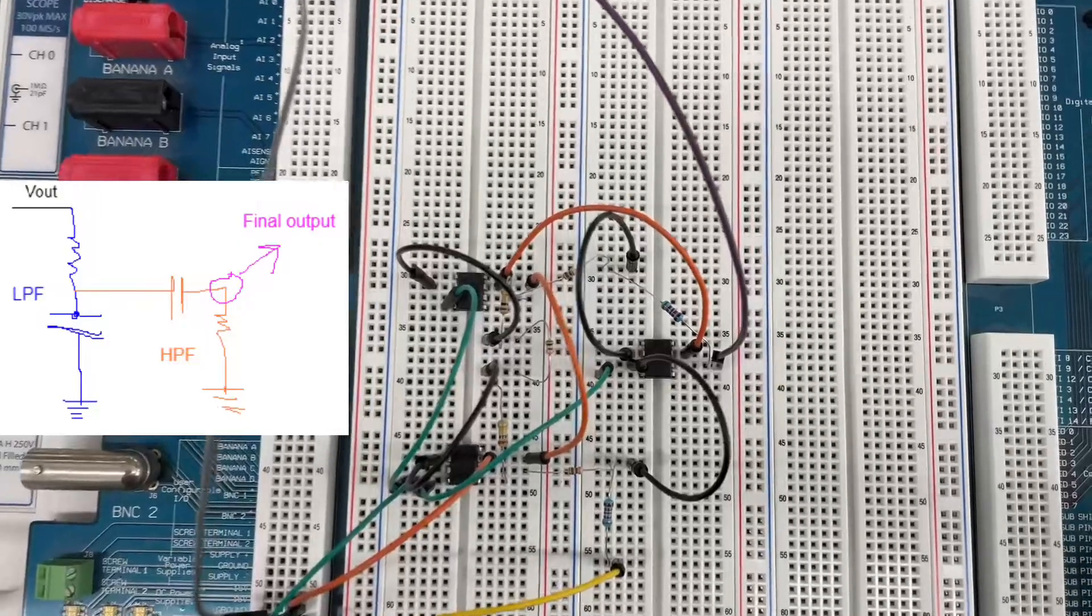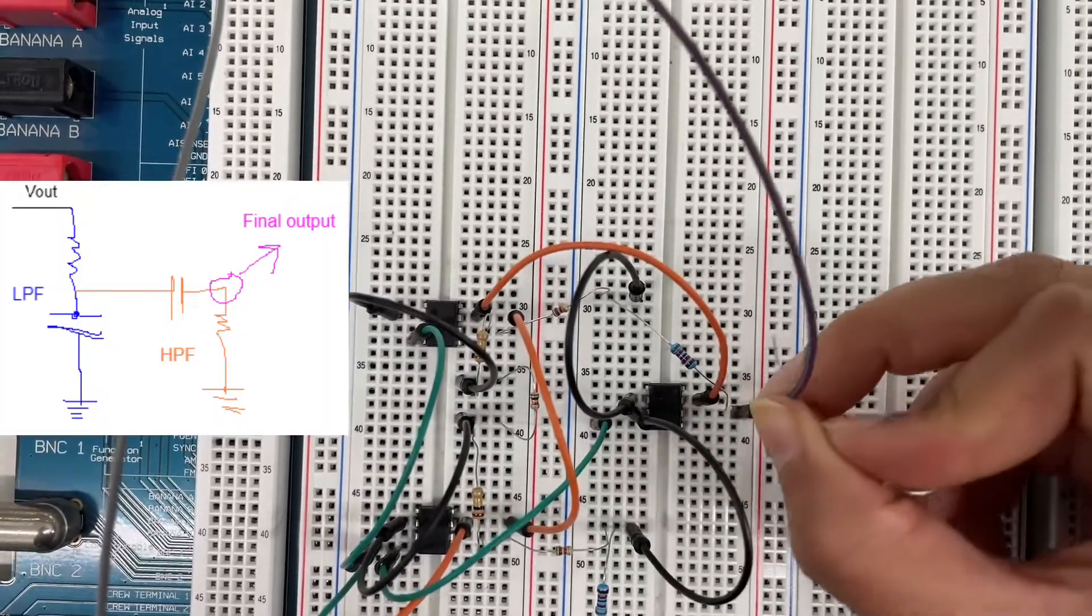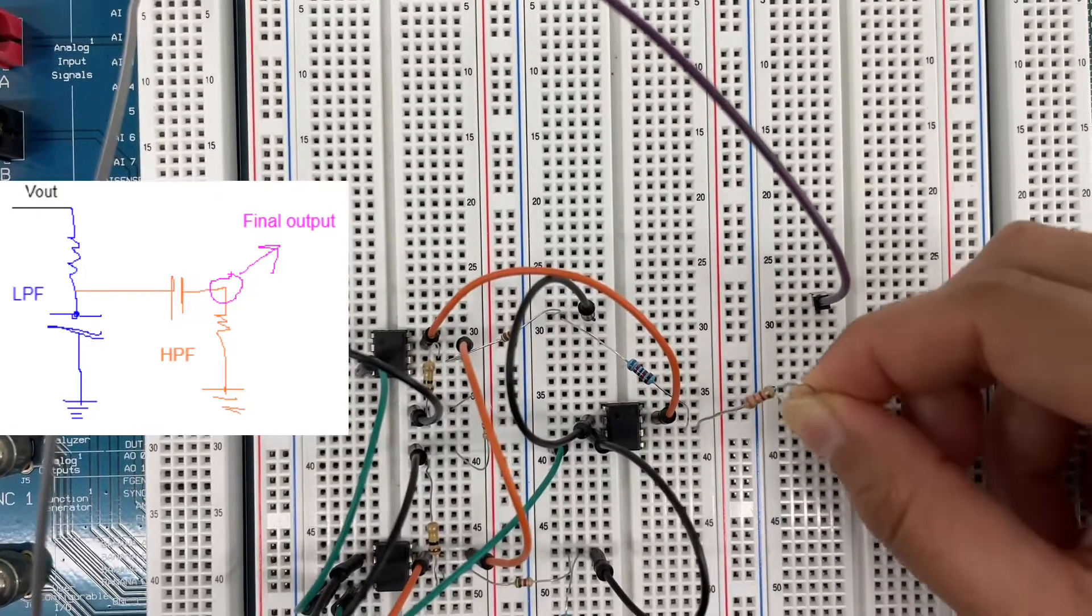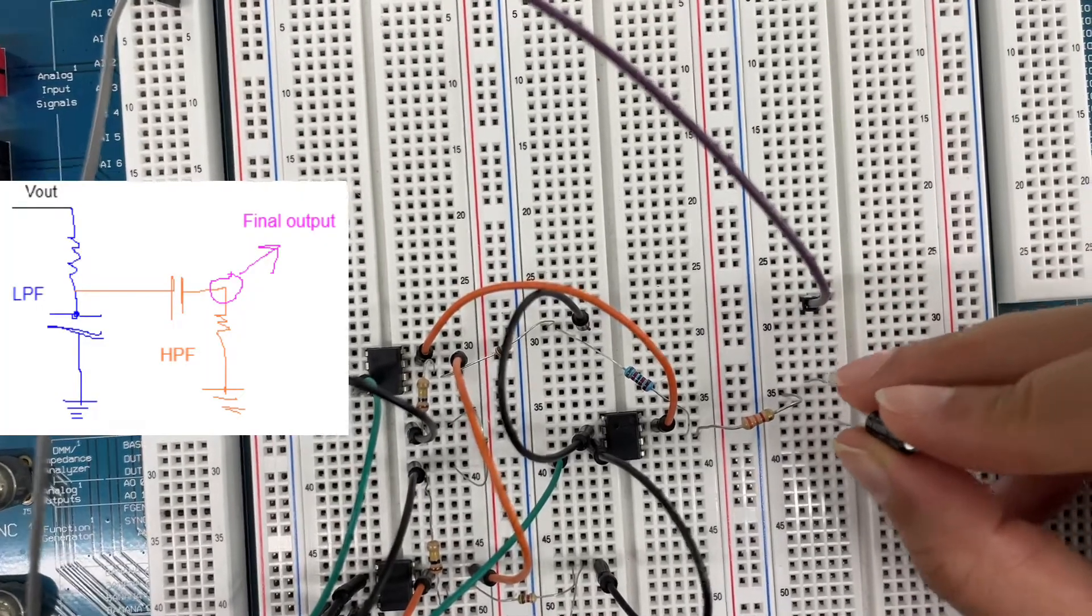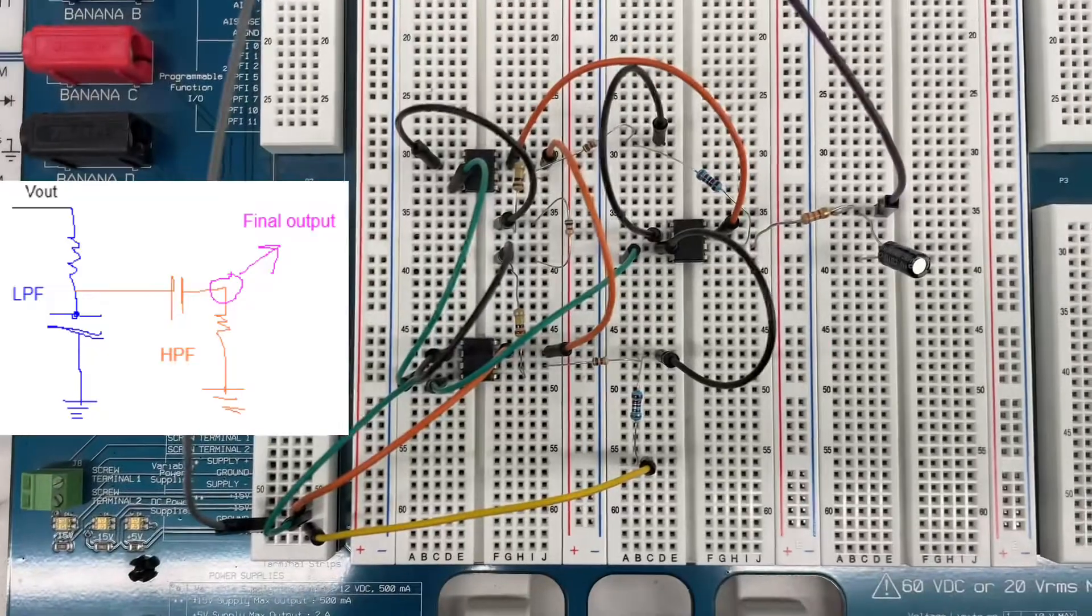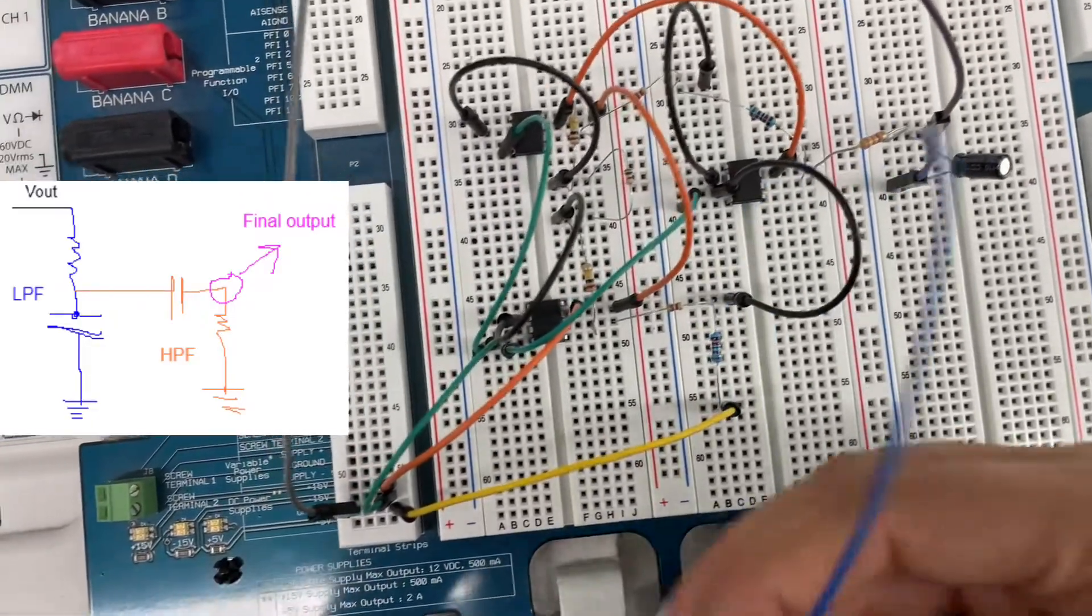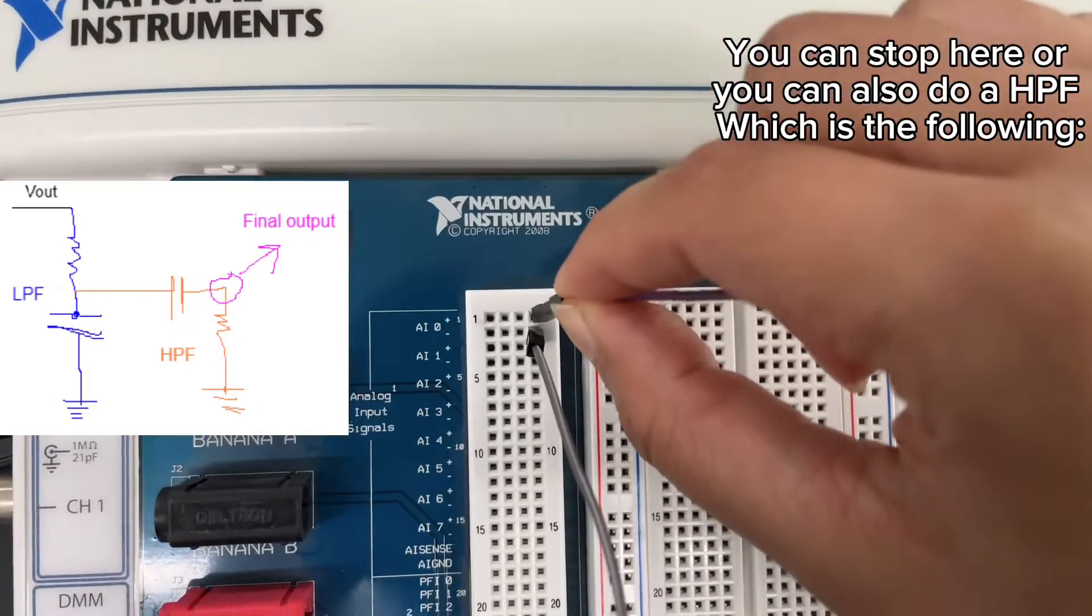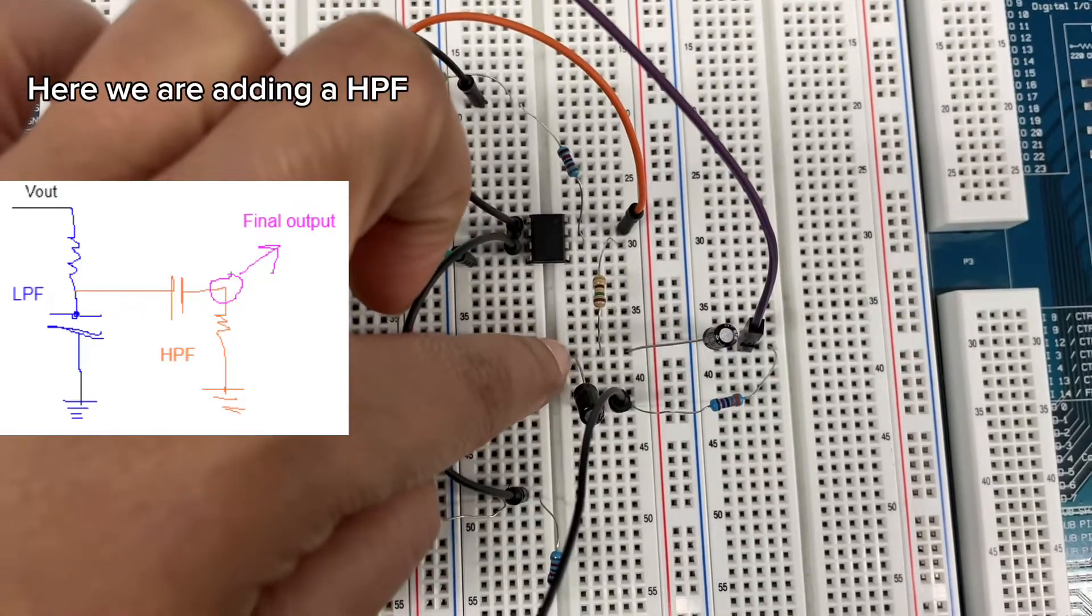In addition to my instrumentation amplifier, I'm going to add an RC filter, a low pass filter from the output of the last op amp. Taking this resistor and a capacitor. This capacitor needs to be grounded. I'm taking the output from between the resistor and capacitor, and this is connected to channel AI zero plus and the minus is connected to ground.